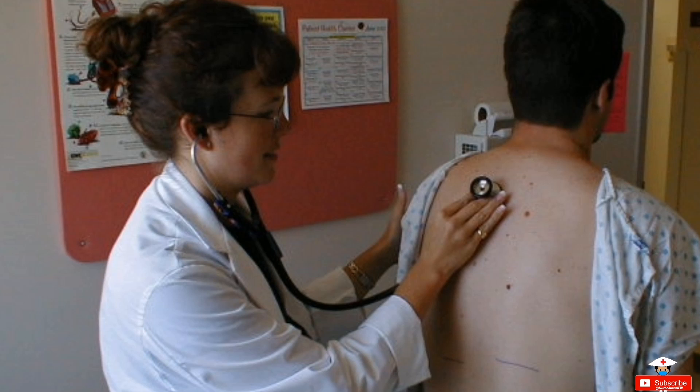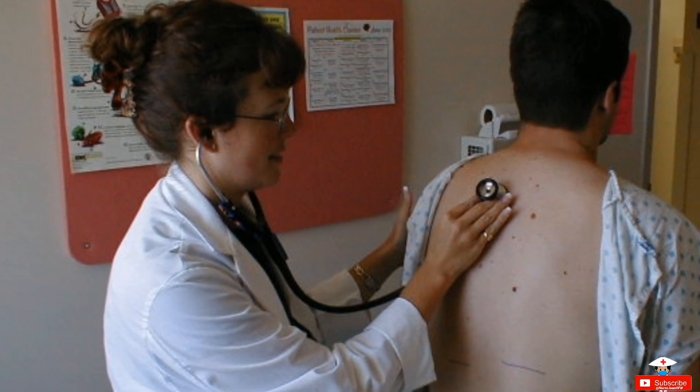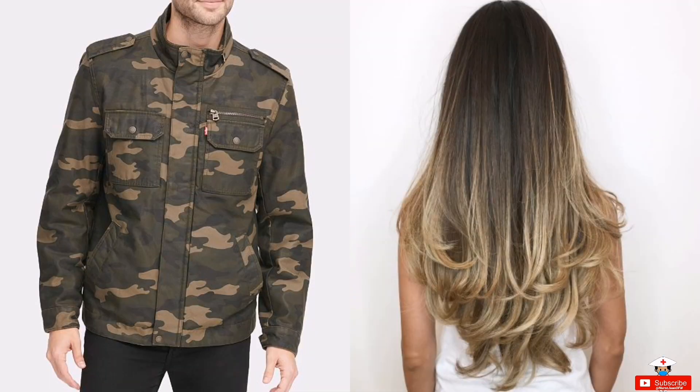Number four: it is better to auscultate directly on the skin to be more accurate and maximize the lung sounds. Clothes, hair, or anything between the skin and the stethoscope sometimes produces sounds that we might mistake for adventitious sounds.